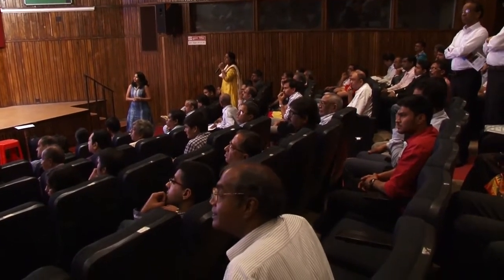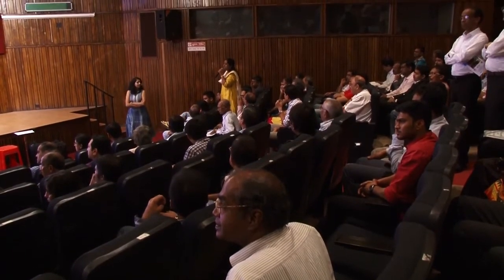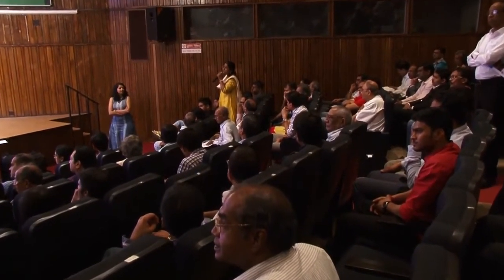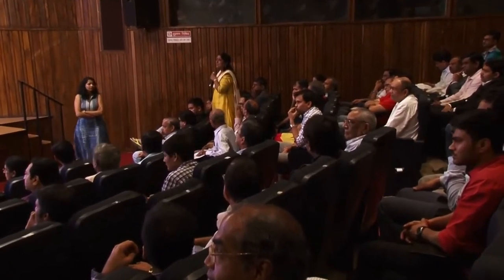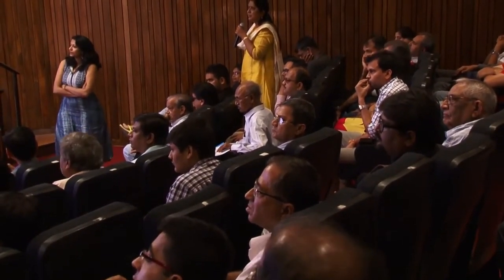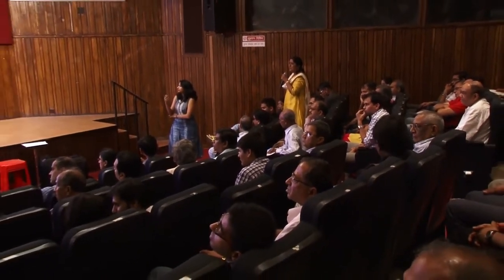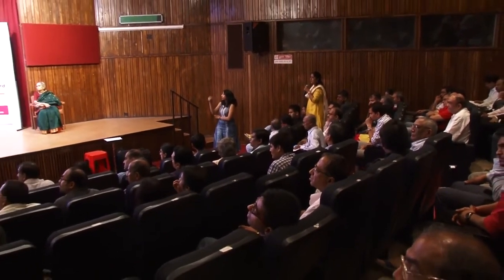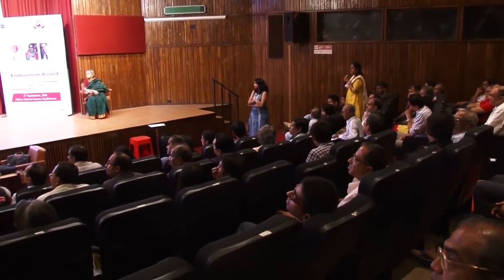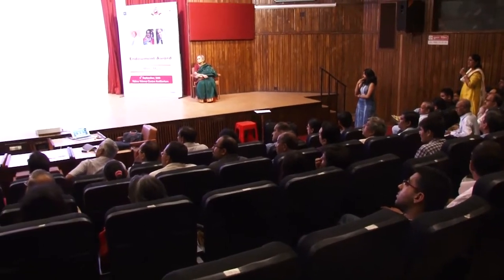So, if he can still read, you say? He can read and write. He's still doing his work. Yeah, I think if he's still reading and he's still doing his work, he's not a suitable candidate for the device. The device is for people who have really bare light perception or no light perception. So when your husband, unfortunately, loses also that ability to read, then will be the right moment to do the implant.